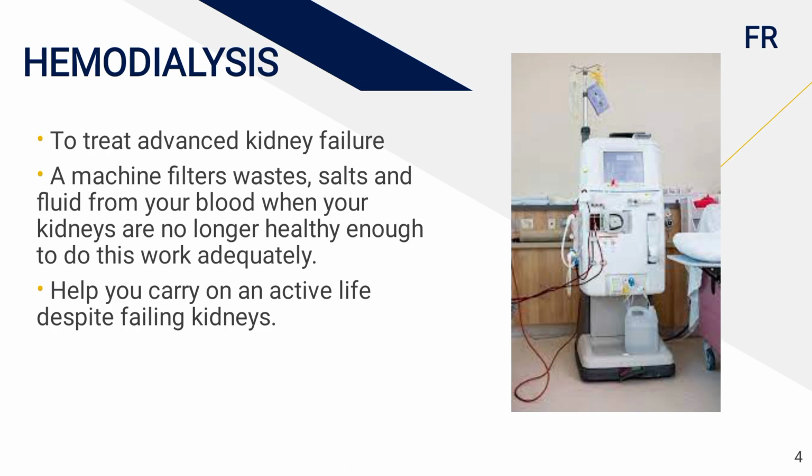But it takes time. When you are in search of an organ, you cannot get a replacement on the spot, you need to search for a donor with the same blood group and the RH type, right? So during the time when you search for a person who gives you a kidney, the functions done by the kidney need to be done by a machine, and that machine is hemodialysis.